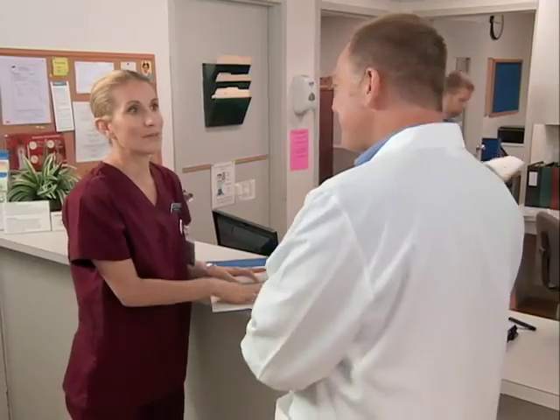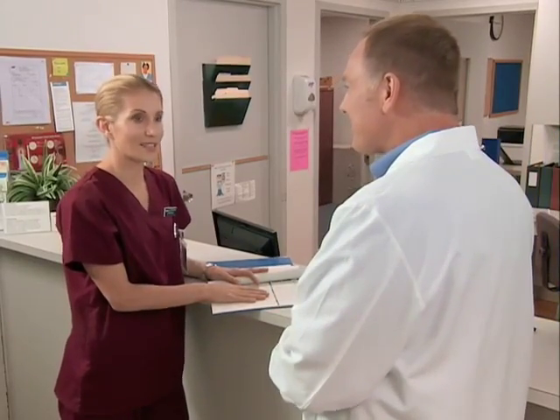Mr. McDaniel, my patient has a tracheostomy and I think site care is done daily, is that right? Yes, usually daily or more often as needed. Well, we reviewed trach care and practiced in the skills lab, but I've only taken care of one patient with a tracheostomy before. Can you help me? Of course, Marissa. I'd be happy to help you.